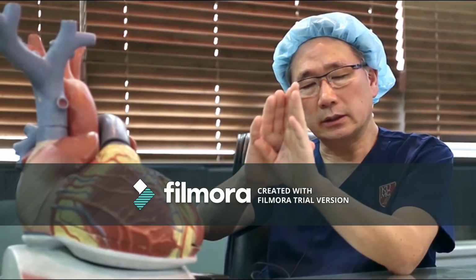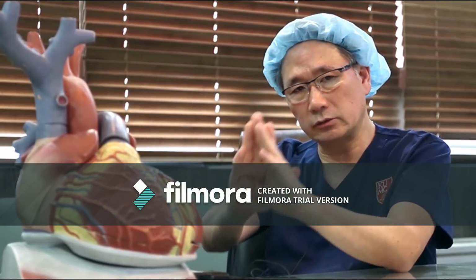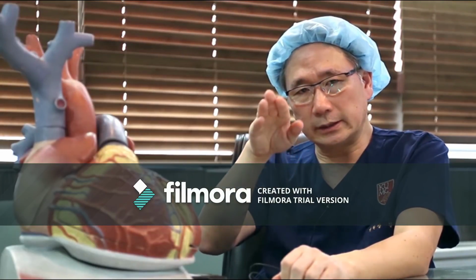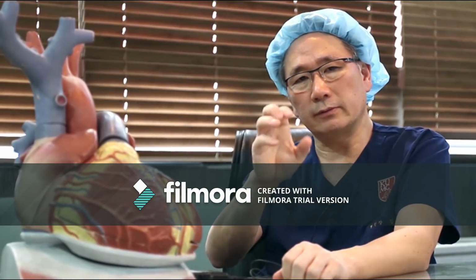After that, the needle usually goes into anterior rotation because of the anatomy. That's the lateral wall of the aorta. And then after we drag down, there is another posterior jump, and it usually goes into the upper margin of the fossa ovalis. After that, this needle is usually directed just underneath the muscular rim of the fossa ovalis.